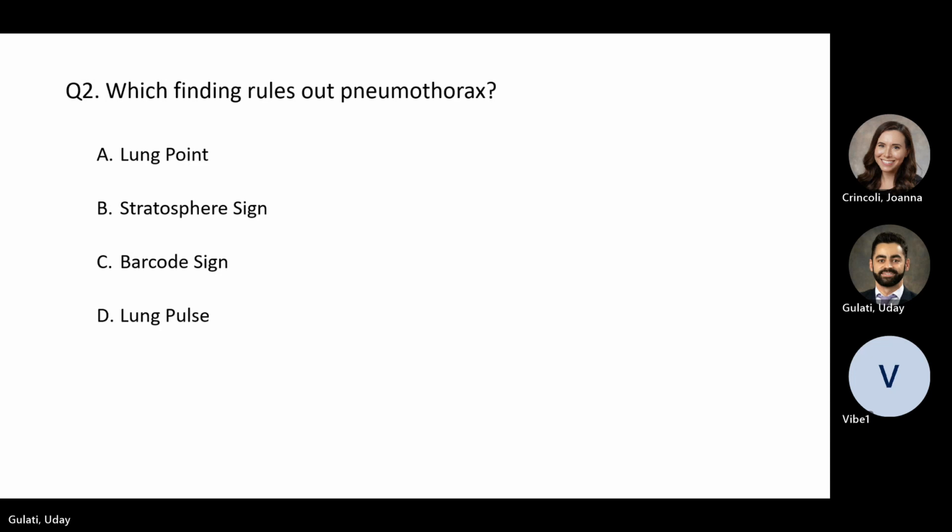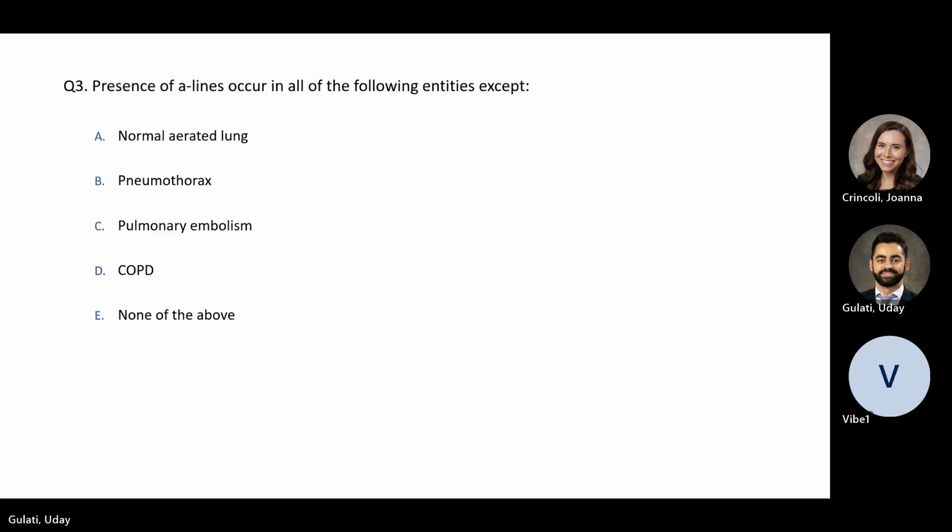It's essentially that passive vibration because of the cardiac cycle. You'll usually see it in the left hemithorax. And it confirms that there's no air separating the visceral and parietal pleura, right? And once again, if you see it in the appropriate clinical setting, it's highly suggestive of atelectasis.